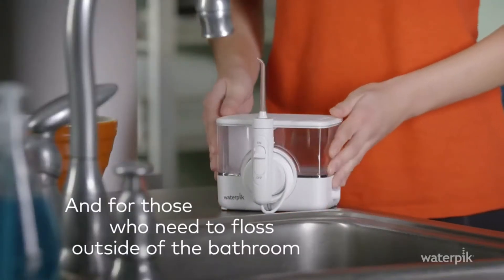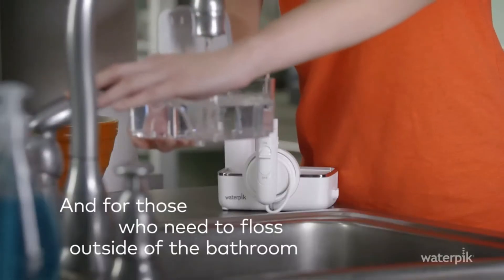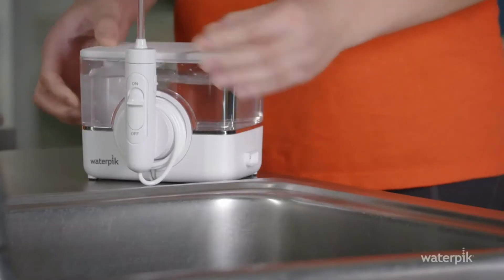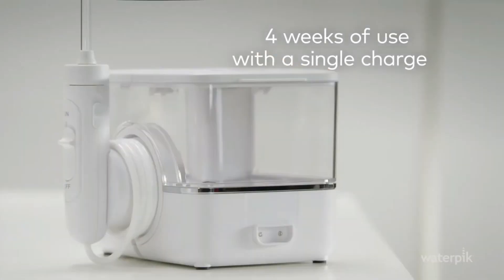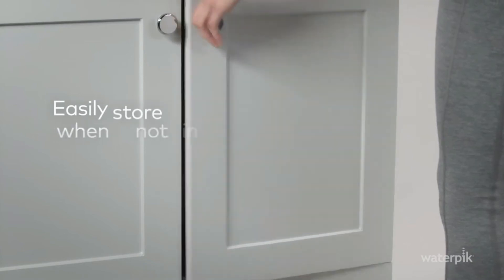The retractable cord keeps clutter minimal, but if you'd like to go cord-free, the handheld flosser includes a rechargeable battery. One tester said: I love that it's wireless and it can sit anywhere I want on my sink.